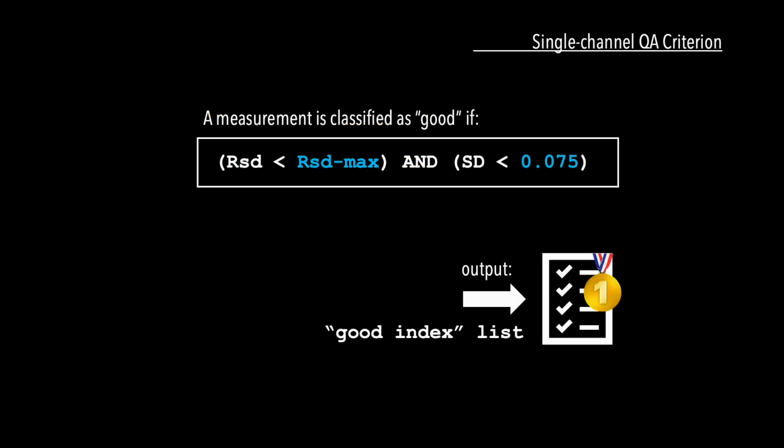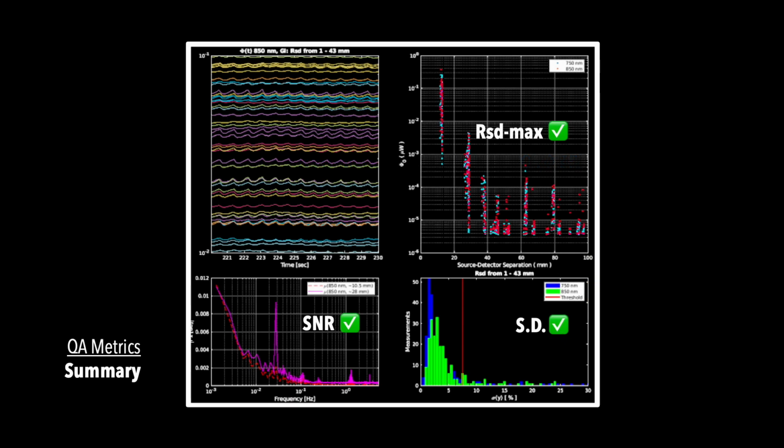You always have the option of rerunning the data quality evaluation after adjusting script parameters to apply more lenient thresholding. However, the default values, although largely derived empirically, have been found to give good results in prior use of NeuroDOT. In this case, a better option may be to take lessons learned from poor results to inform the planning of future experiments and avoid additional problems as the study proceeds.